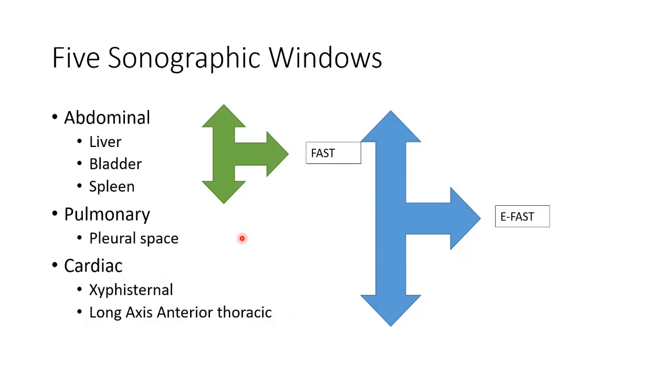And a thorough EFAST exam can be done within 5 minutes and gives you tons of information about the patient, because it allows you to stabilize the patient, to know where the problem may be, start doing interventions that will help to stabilize, determine your fluids. So it's an exceptionally good tool to have. And it's something that I think every doctor, once they reach at least the end of community service, should be able to do. And if they haven't been able to do it by that stage, at least as a first year MO or at any stage of their life, they can learn how to, but ideally you should be learning it in your junior years, okay?